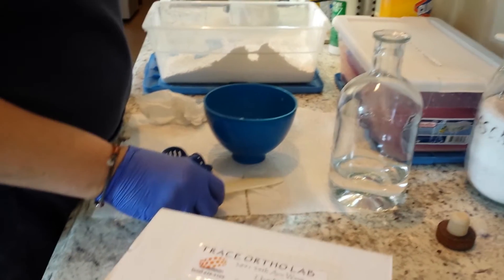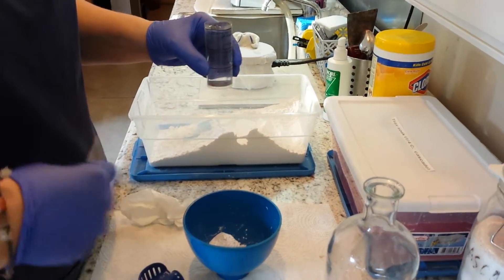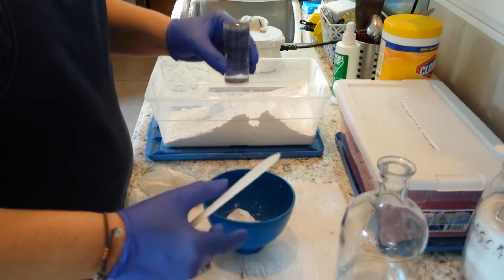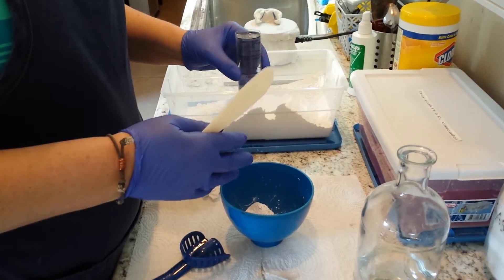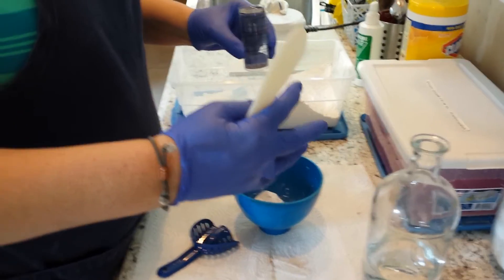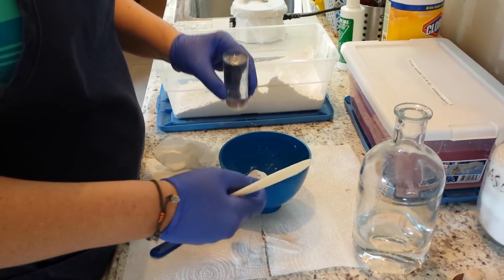We have about three scoops of water here that we keep in a bottle at room temperature daily so that we don't have fluctuation in the temperature. If you use tap water, it will vary in temperature — you can't use ice cold water and you can't use hot water. Room temperature water is very accurate and the set time is usually the same.